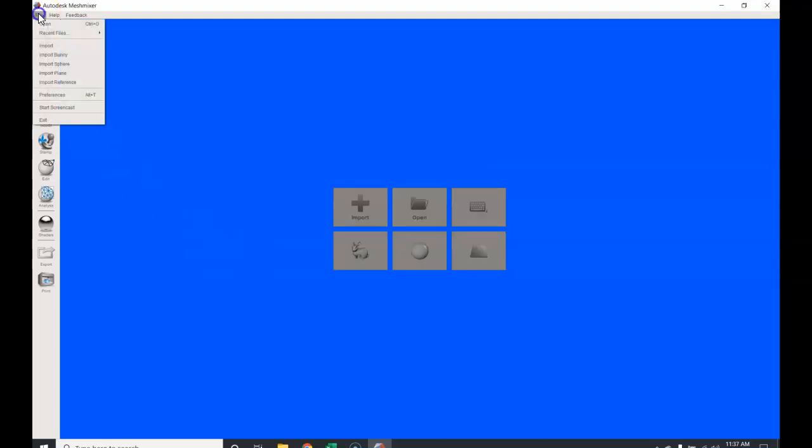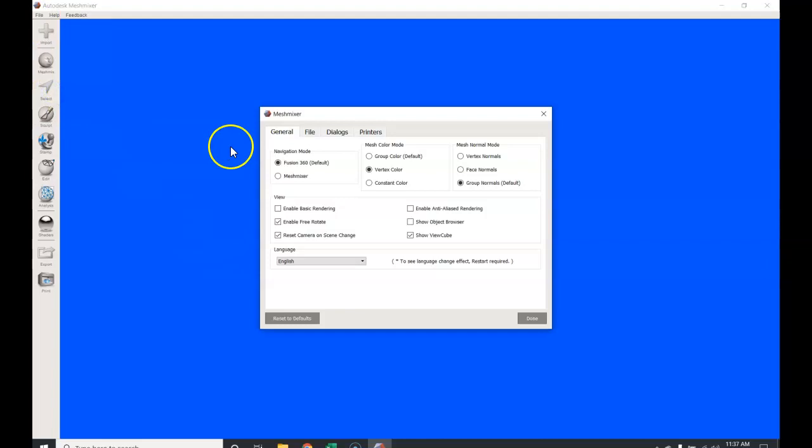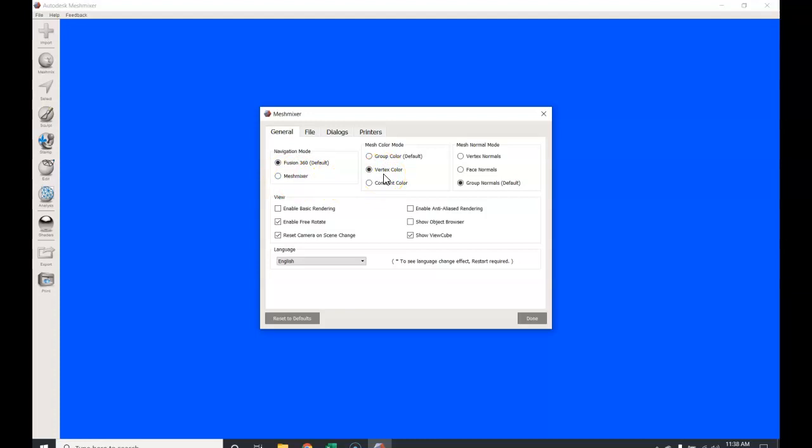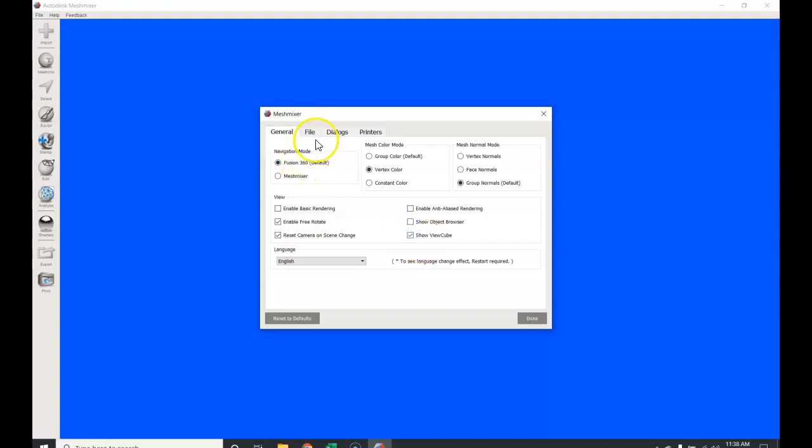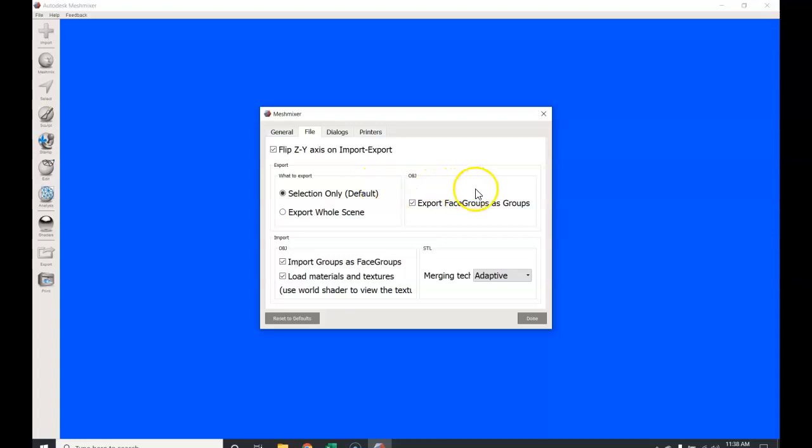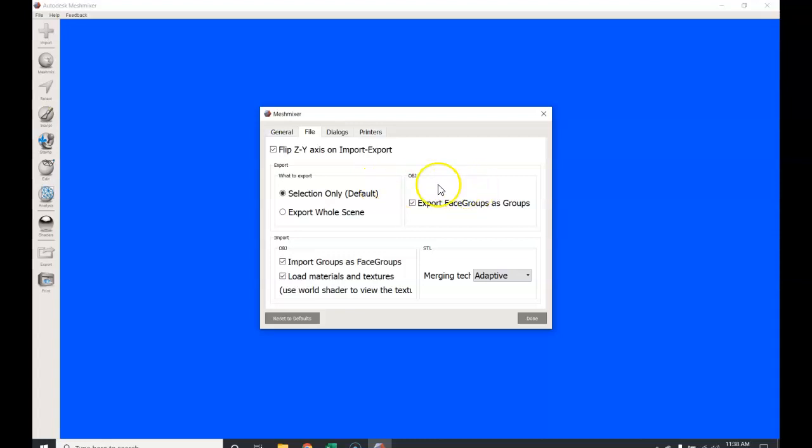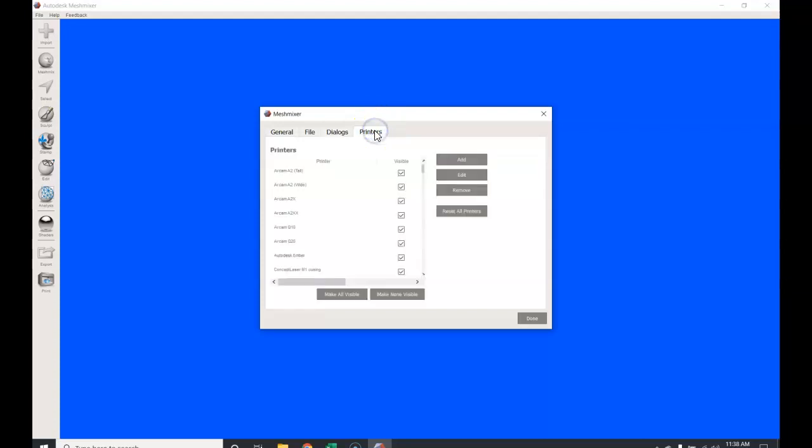Secondly, we're going to go up to file preferences. In the general file I utilize Fusion 360; that's just navigation mode. My mesh color mode is vertex, my mesh normal mode is the group normals default. I do like to enable free rotate right here. I believe that the default is reset camera on scene change and show view cube. The file I have it pretty much set; I believe these are all defaults. Same with dialogs defaults. There is a printer tab if you have one of the printers on file; a lot of these are old. I utilize my own printers and my own slicer software, so this is somewhat irrelevant.